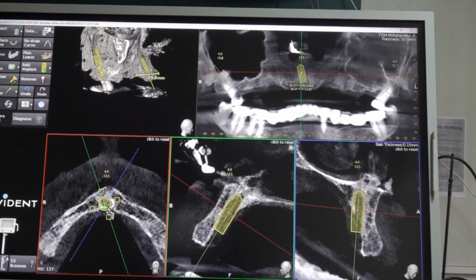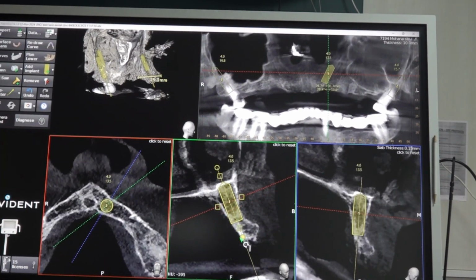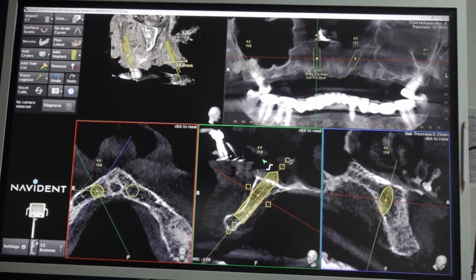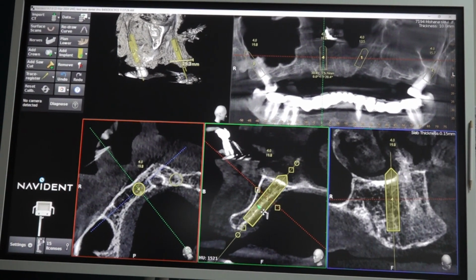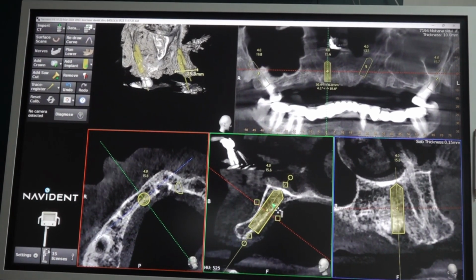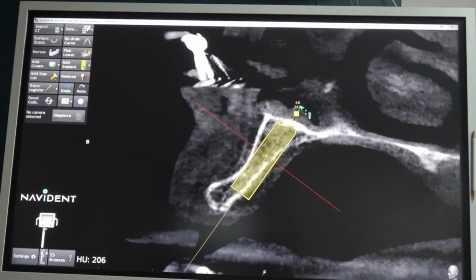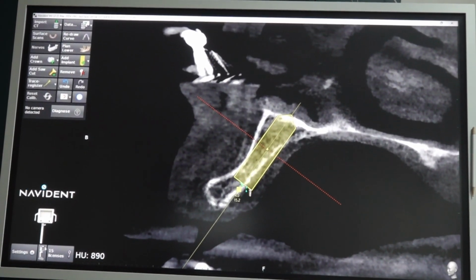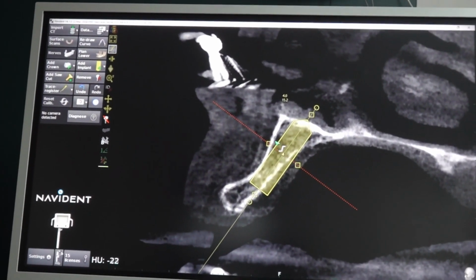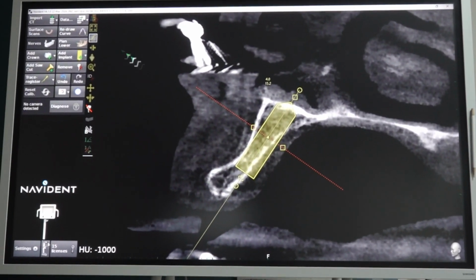Better stick to the previous plan. Now we will be placing another implant in the 12-11 area. Very thin bridge, palatal approach only. Minimal diameter implant, 3.75. Compared to the left side, the bone is very thin here, right? See, there is a severe disruption. Concavity. This is a natural concavity in the lateral area. Whenever you see this concavity, that means this is in the lateral area.